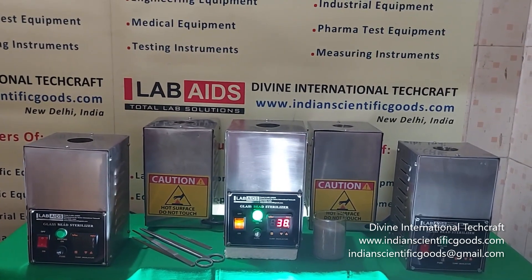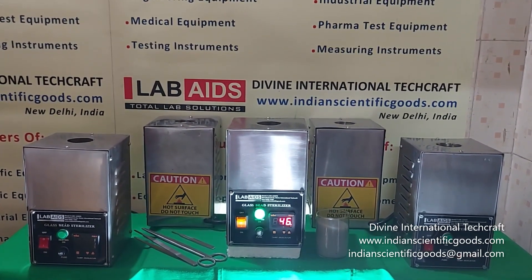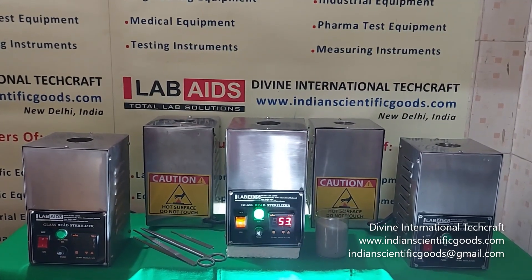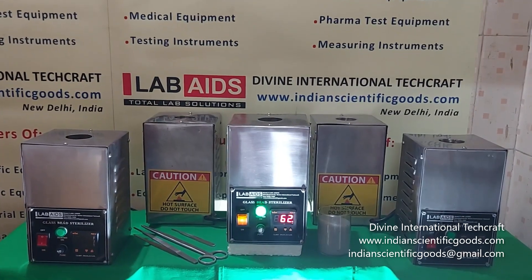Hello, these are glass bead sterilizers manufactured by Divine International Techcraft, New Delhi, India. These are also known as Steri-Pots or Micro-Bead Sterilizers.